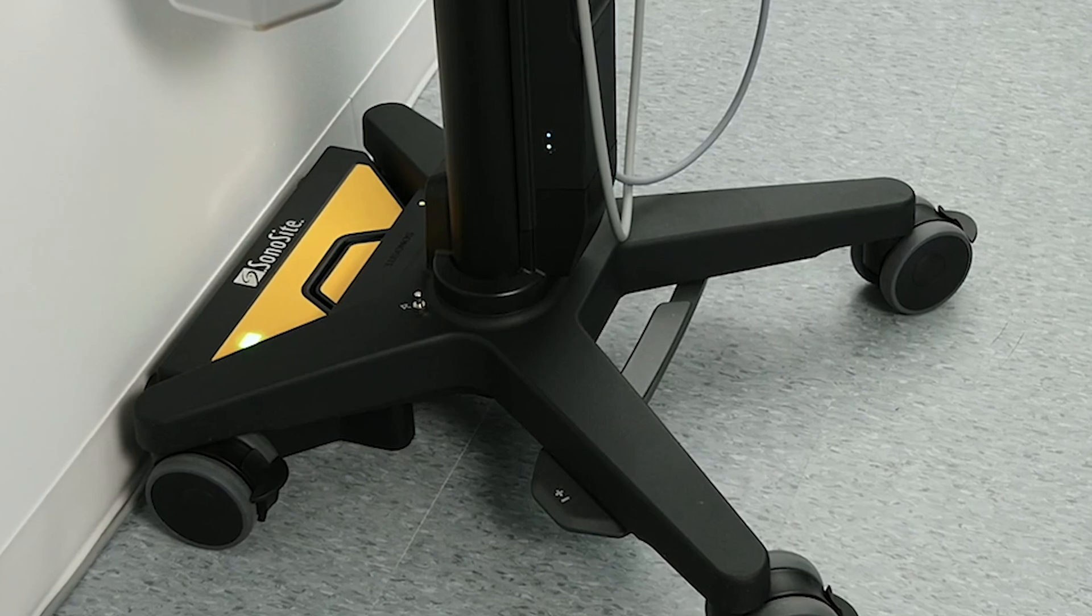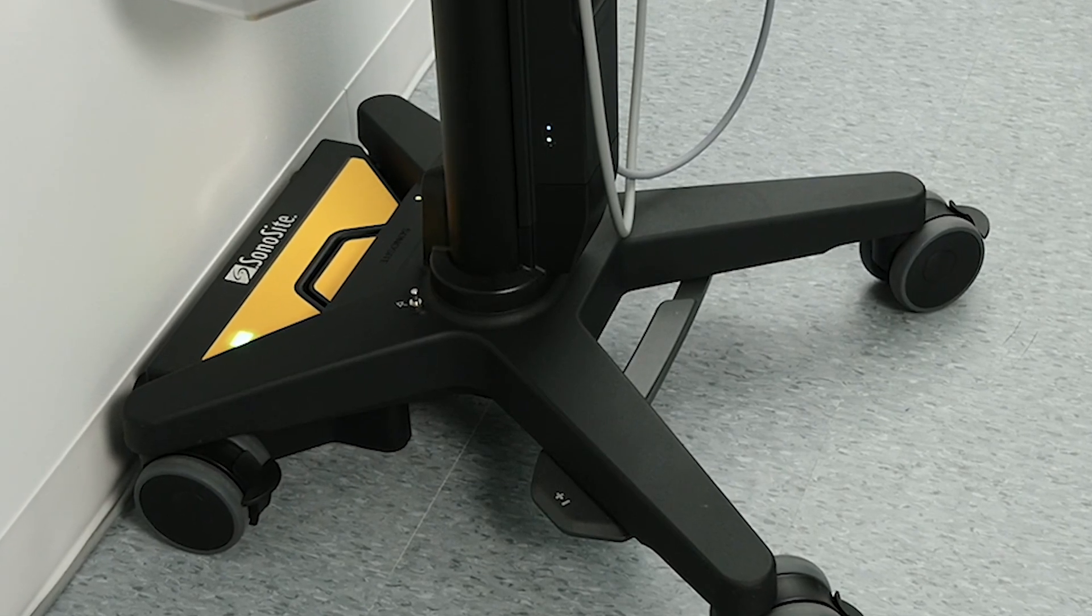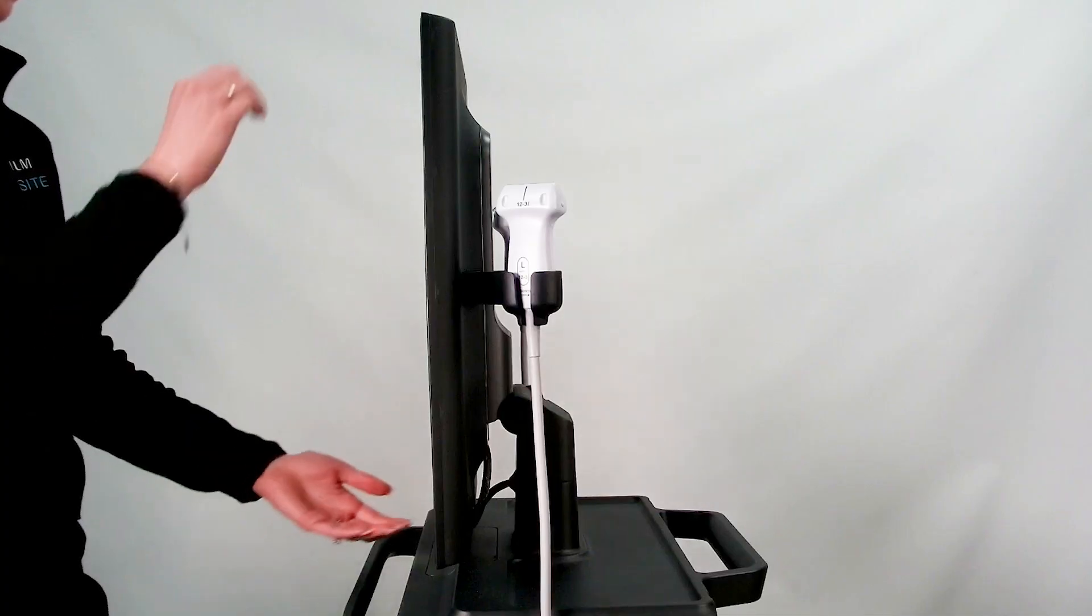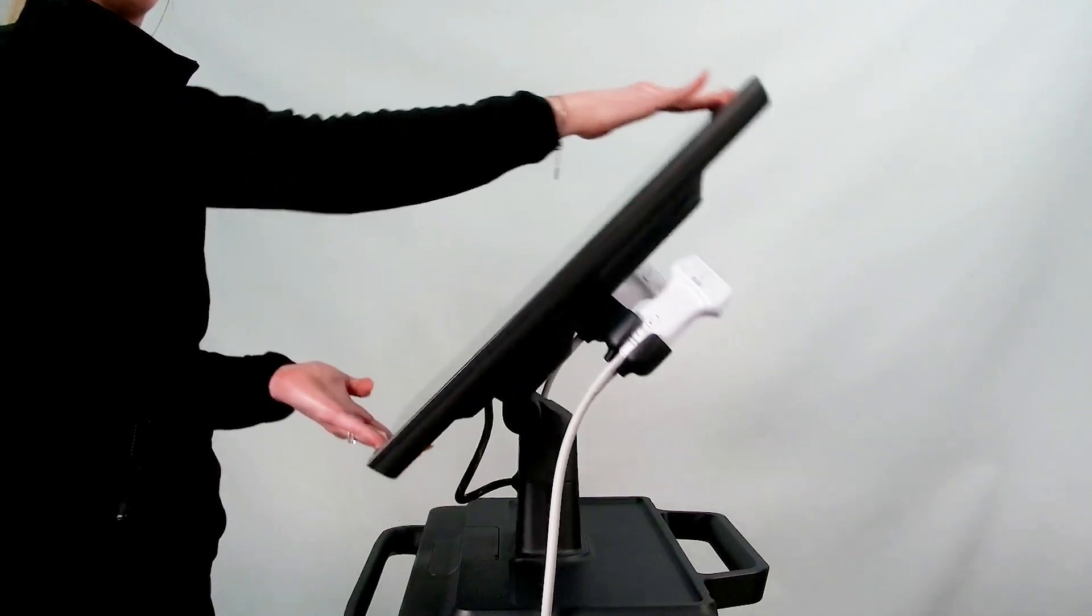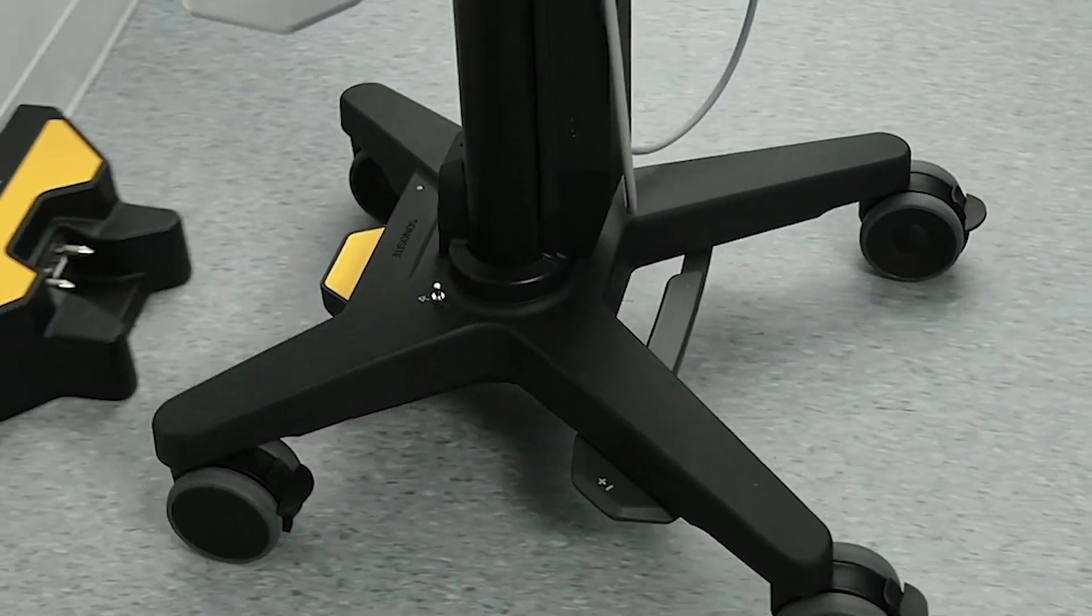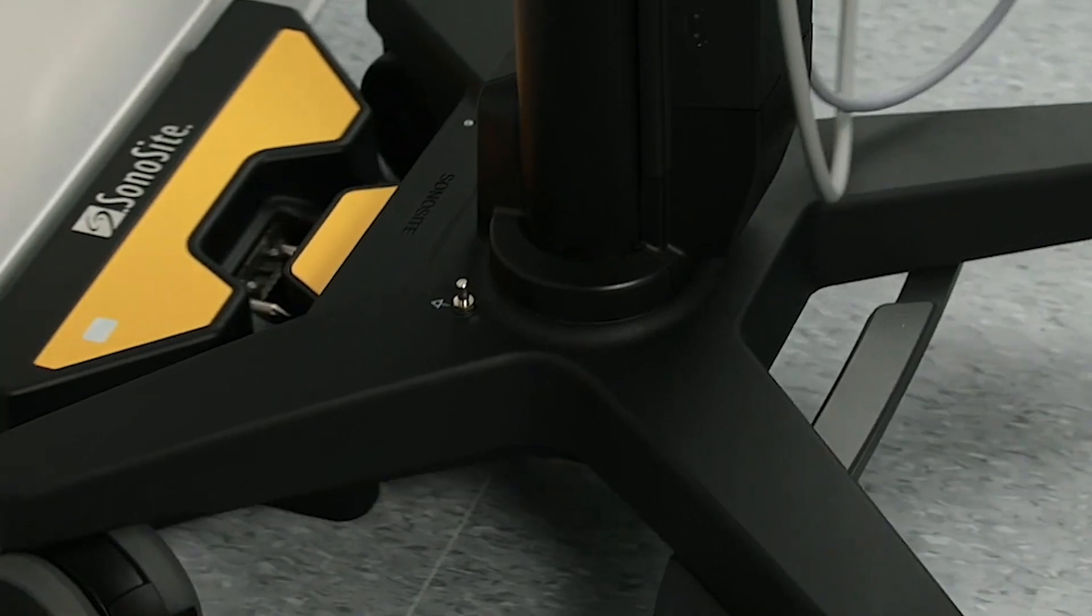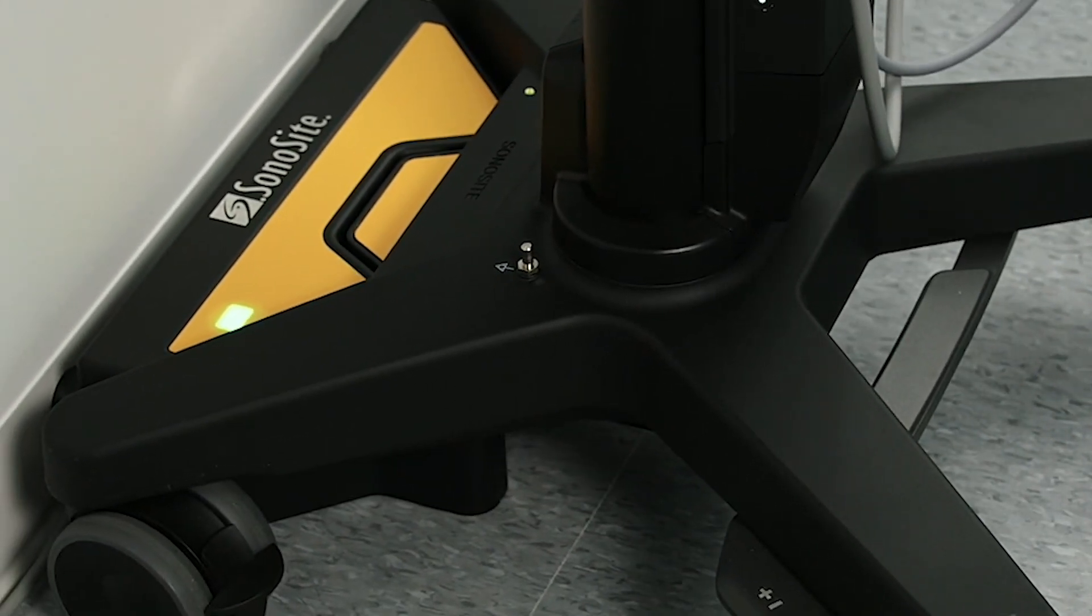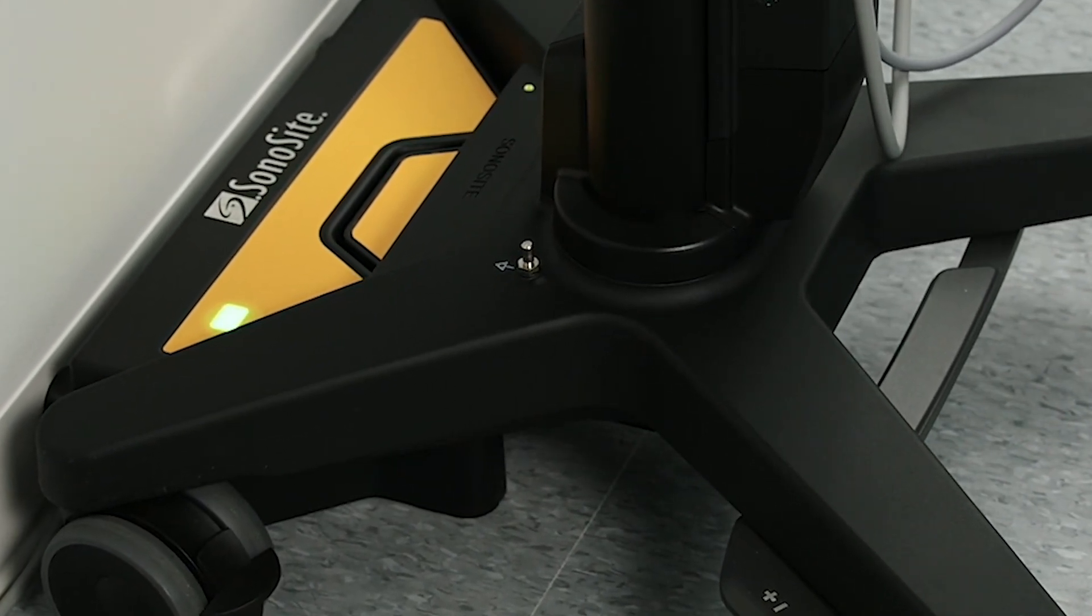A convenient way to charge your system is by using the Sonosight Power Park. Before transporting your system, make sure to tilt the clinical monitor down. Then, wheel your system to the Power Park module and push the back of the stand into the dock, making sure that the stand clicks into the dock.